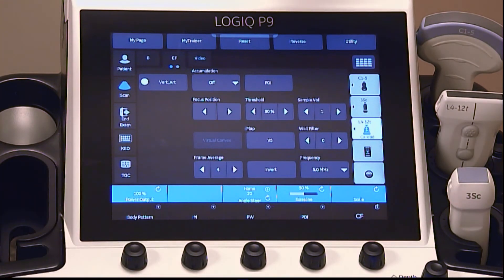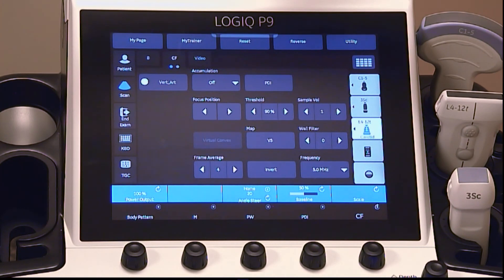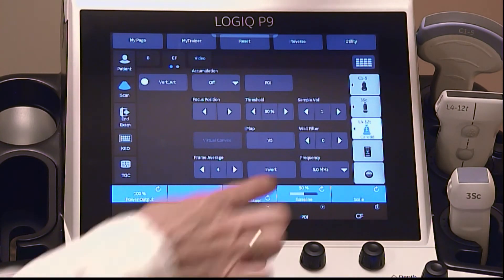The frequency changes the color parameters to enhance flow in different depths. Use lower color frequency for deeper vessels. Increase color frequency for superficial vessels. The range is dependent on probe and on model.